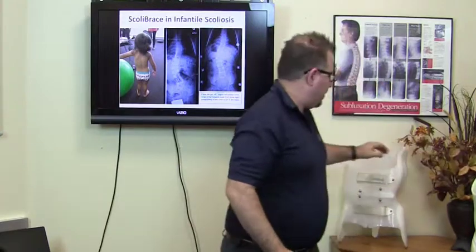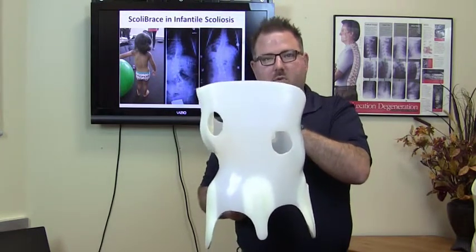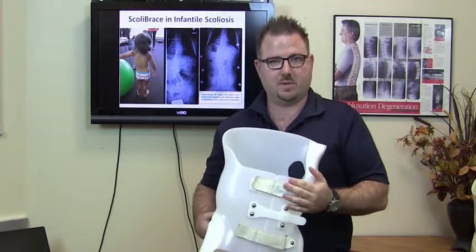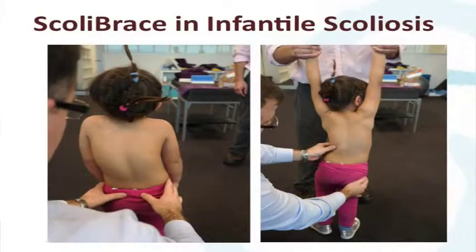The Scolibrace approach is different. With the Scolibrace approach, we use a true three-dimensional overcorrection. This is in fact the back of the brace. We think it's better to direct the forces into the spine rather than try to push through the stomach to affect the spine. It's also much more patient-friendly — the patient can open and close the brace themselves, so they don't need an assistant or a school nurse. Here you can see the difference: this patient was switched to a Scolibrace and the immediate effect is a complete straightening of the spine.